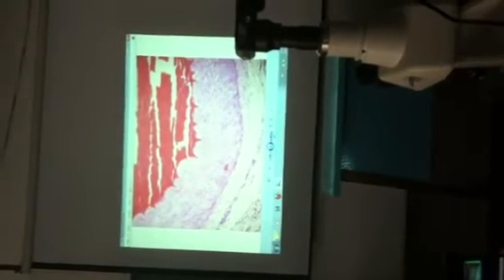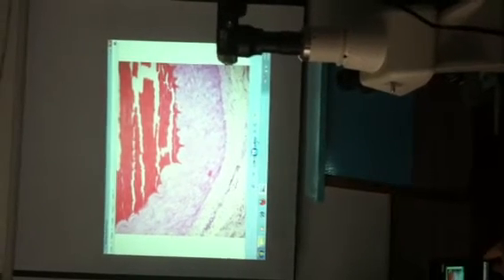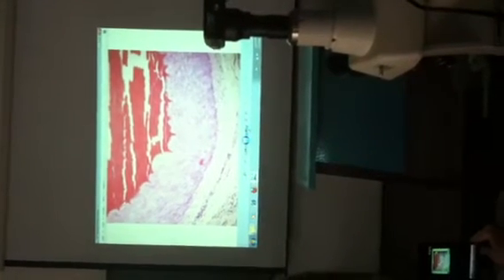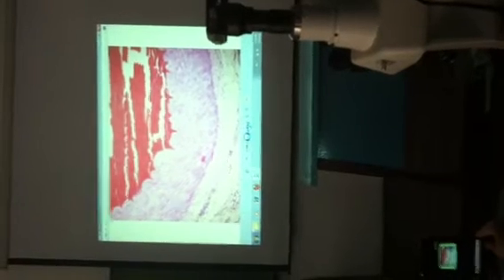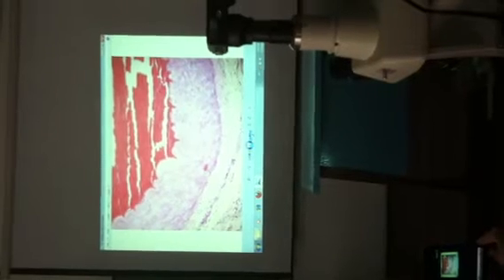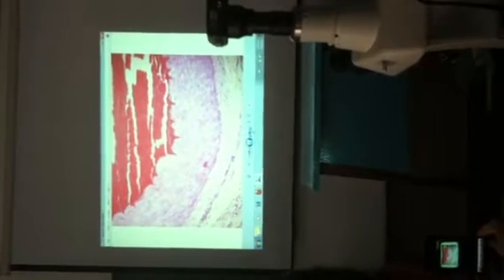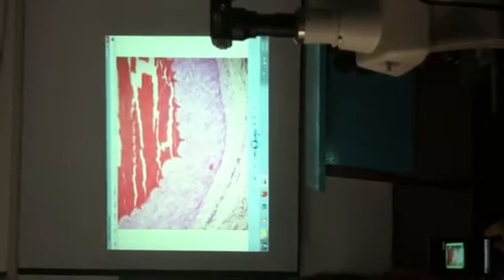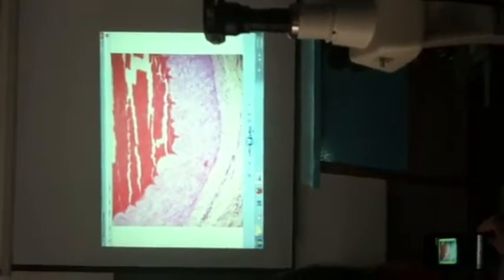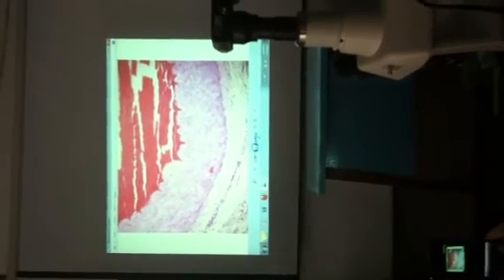Next session is epithelium. You were already lectured during the lecture on epithelium. Epithelium lines body cavities, lumens, surfaces. Keep that in mind. And having that in mind, that epithelium lines spaces, lines cavities, lumens, the epithelium can be classified into simple if there's only one layer, and stratified if there are several layers. Okay, so where is the epithelium now? Lines the cavity. This is the lumen.